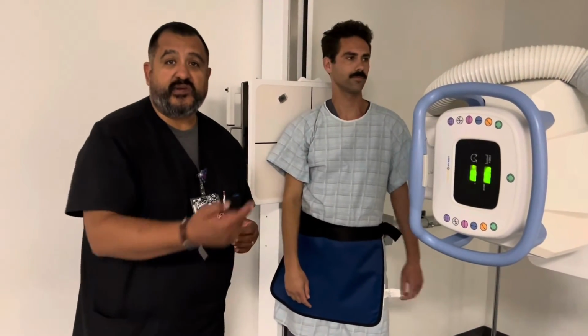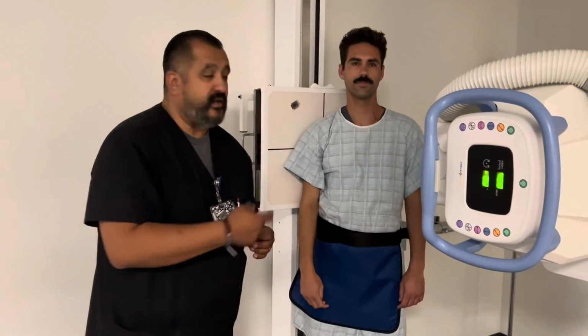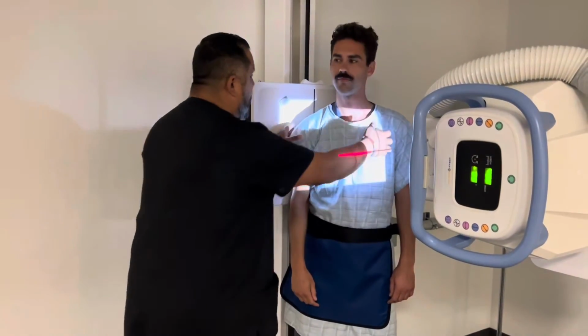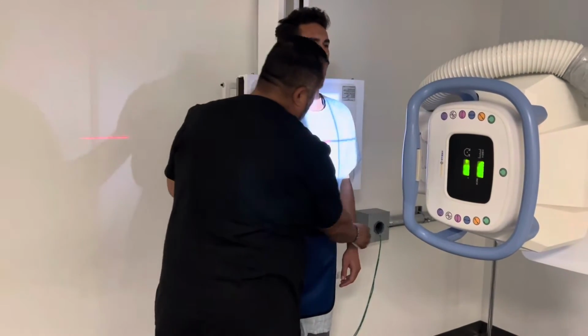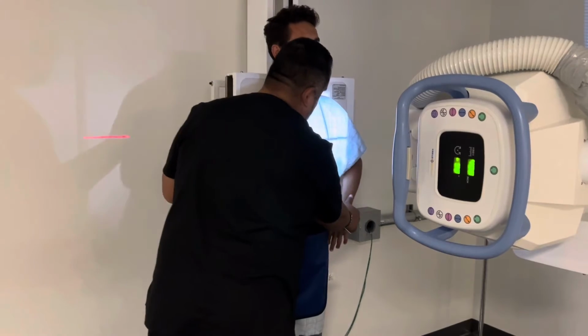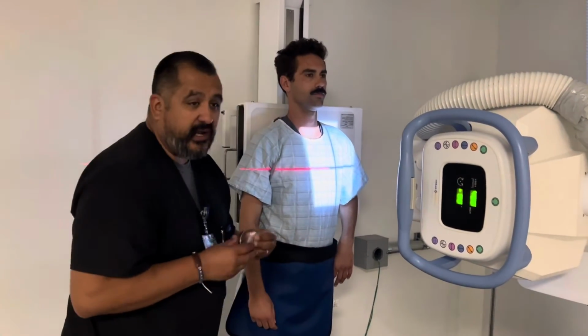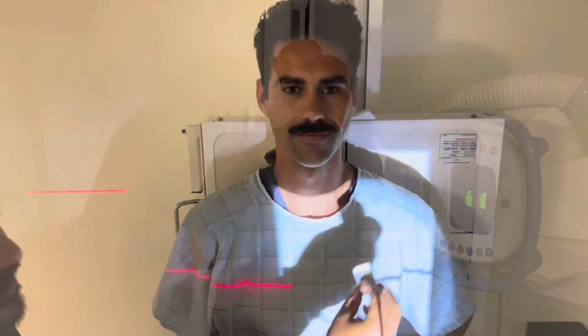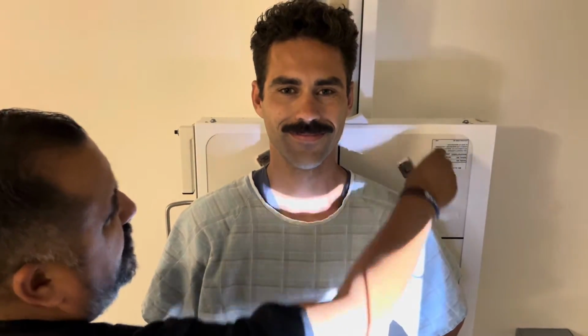Now we're going to go ahead and transition into the left posterior rib injury, okay? So I'm just going to go ahead and have him put his back against the board here again. Slide over to your right. You're going to bring this arm up, just kind of bend it a little bit. And again, you want half of the half. So I'm going to put my left marker over here. So now we're going to place this left marker over here just on that top shoulder. And again, this is for the left posterior rib injury.